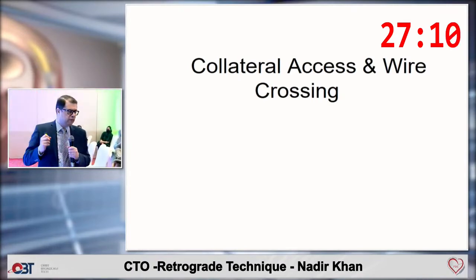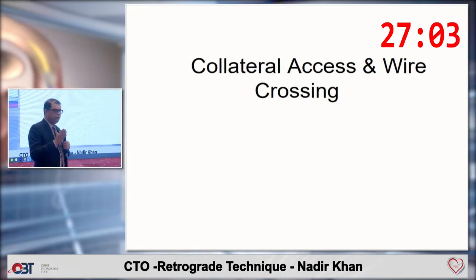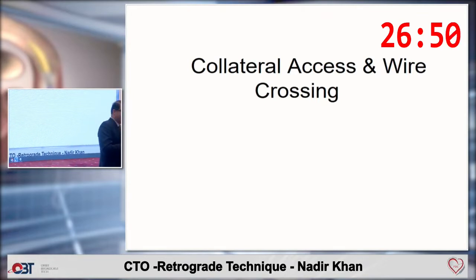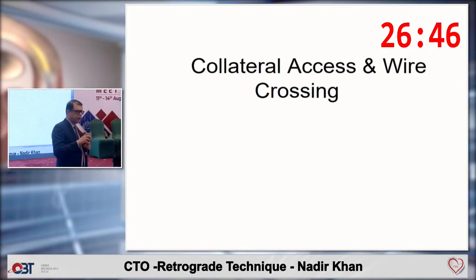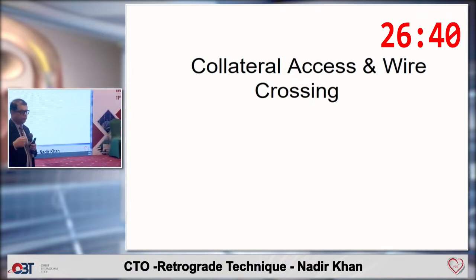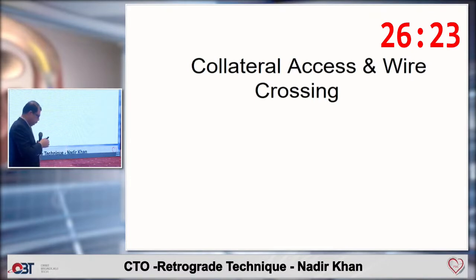And also another thing is that perforations usually don't happen with wires, or even if they happen, a wire perforation in a collateral is usually not that dangerous. But it is when you push your microcatheter. If it is not going, don't push. Find out a reason why your microcatheter is not going. And try to take a microcatheter which you can rotate, because Caravelle and FineCross you can't rotate. You have to push, and at times pushing is not adequate. So Corsair or Turnpike catheters you can rotate, so that you can reduce the friction. And try not to push the microcatheters, because that's when the problems happen.